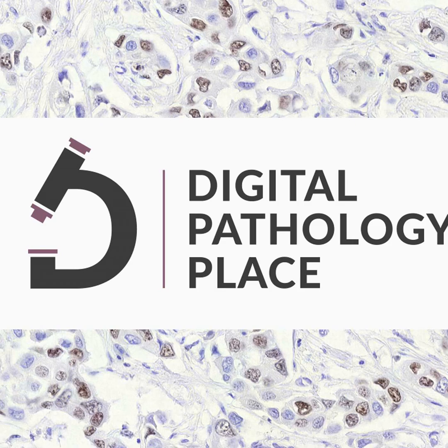In this case, and specifically with pathology images, it means robust to changes in the images. So it could be they were scanned on a different scanner, they're from a different lab, the stain intensities are different because of something in the processing, or they've faded over time, or maybe a different population of patients. So any of these changes can create a difference in appearance in your images.